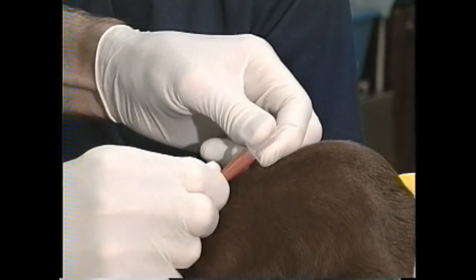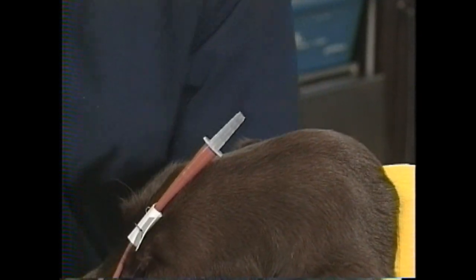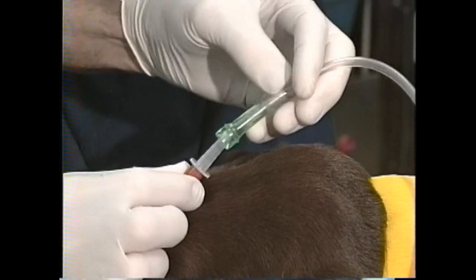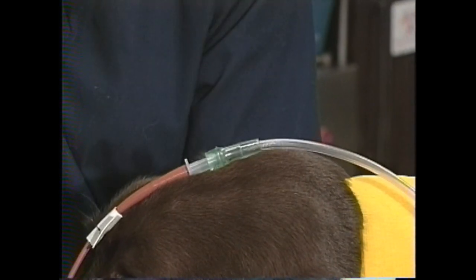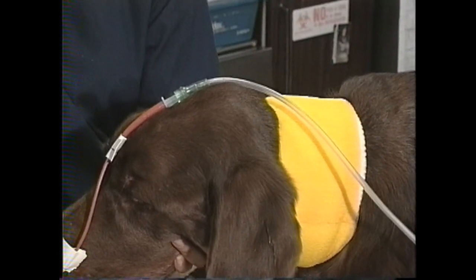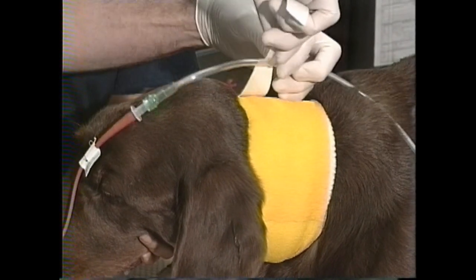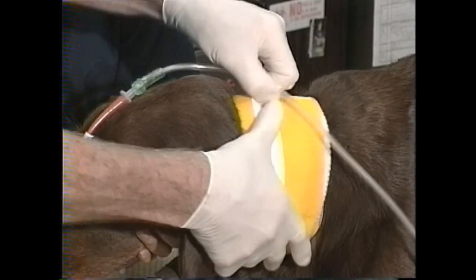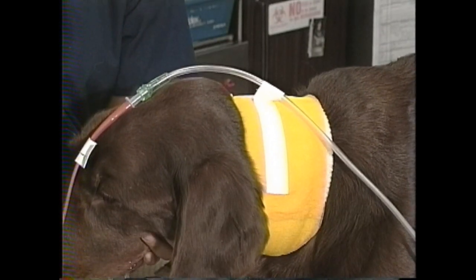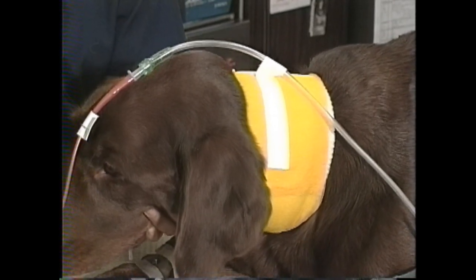We use plastic connectors that adapt the flare on a feeding tube to a medical grade oxygen line, and then that oxygen line gets taped to the dog's bandage. When it's taped the dog's face should be tipped down again to mimic normal motion and ensure that when the dog goes to eat, drink, or lick its front feet it doesn't put too much tension on the suture over the frontal sinus. That piece of white tape is going to do all the holding of the tube to the dog.